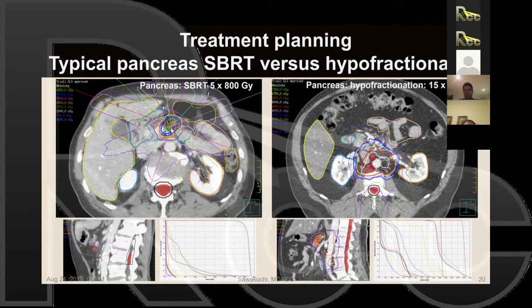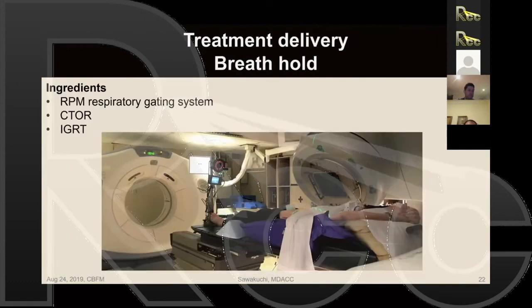Actually, if I look at this more carefully, this seems like it's an IMRT plan. Oh, sorry, never mind. I take that back. So these plans are all IMRT. They're not VMAT. The reason is our CT on rail machine does not have a VMAT license, and so we have to treat these with IMRT. But with VMAT, you do have the option of using multiple arcs. And for lung treatments, it's usually 2 arcs. Not 2 full arcs, but partial arcs.